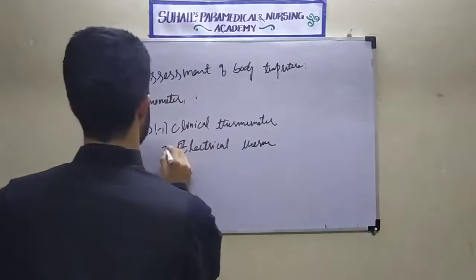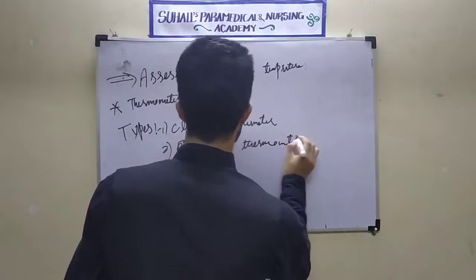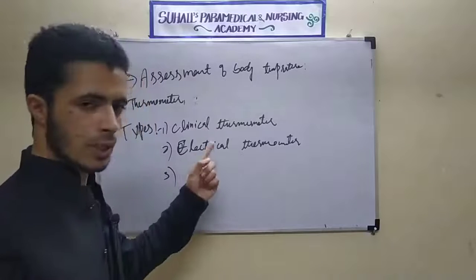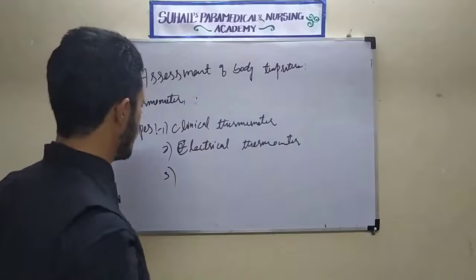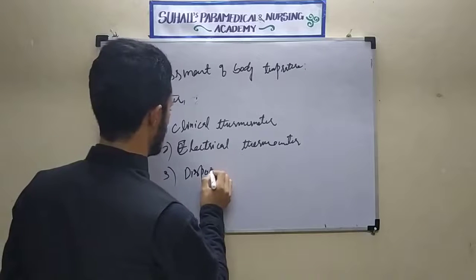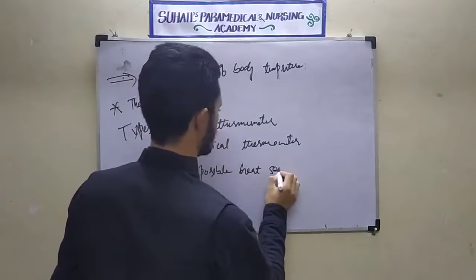This is the first one, this is the second, electrical thermometer. And the third one, remember: clinical thermometer, electrical thermometer, and another is disposable heat sensitive thermometers.